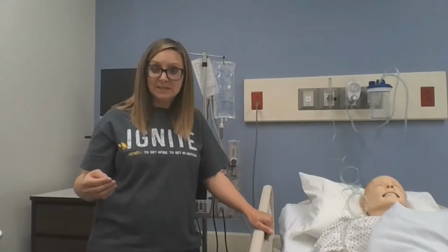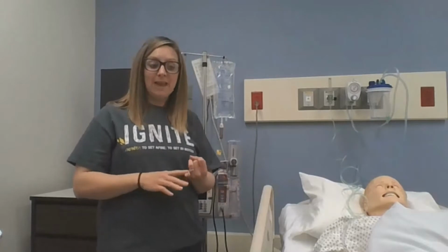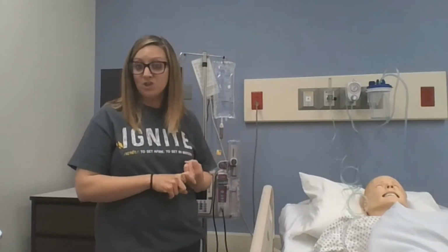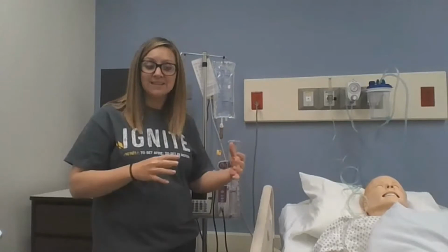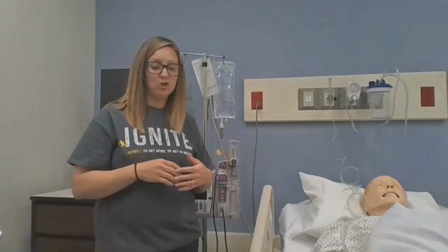PCAs are great and they're wonderful, but it's really important that we have good nursing practice associated with it. So what does that look like? What is good nursing practice for a PCA pump? It would mean that we want to make sure that our patients are out of the bed and sitting up in the chair as much as possible. If they can ambulate, let's do that. It gets really hard to do that because with the PCAs, sometimes they get kind of tied down with a lot of different extra lines and tubes.